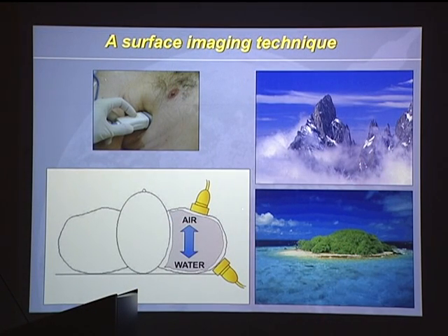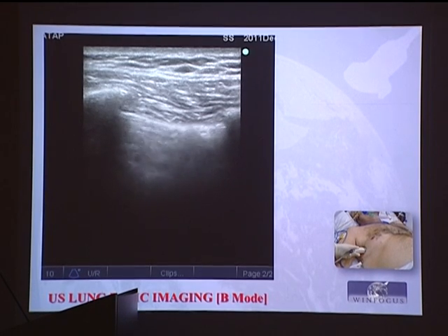And you should always remember that air and water distribution in the lung will depend on gravity. Why is this so important? Because all the ultrasound images are born by water or air, or a mixture of the 2. So the degree of air and water that you will find will create a different imaging. So it's very important that you always think about what you are expecting under your probe, and then you can better read the lung ultrasound image.